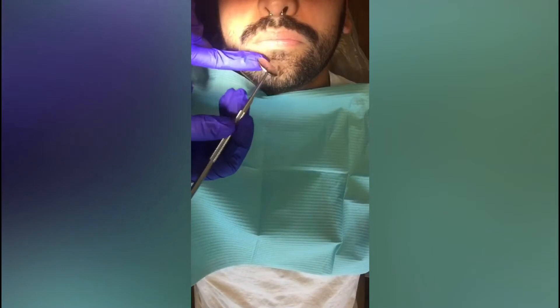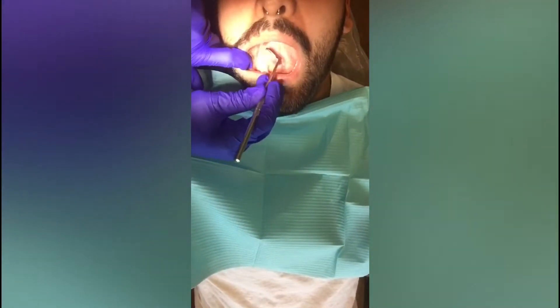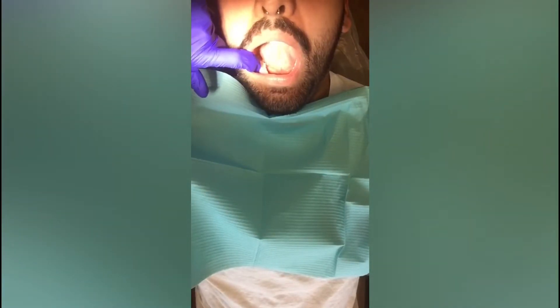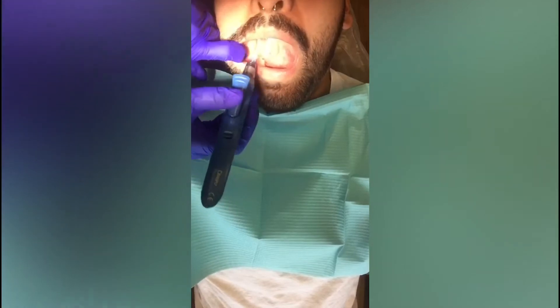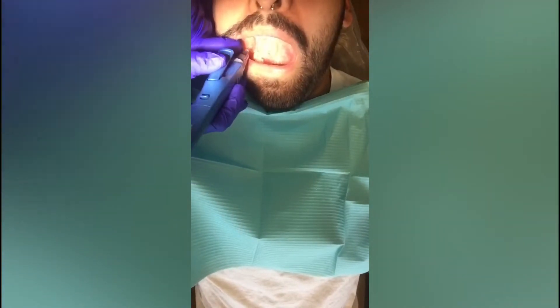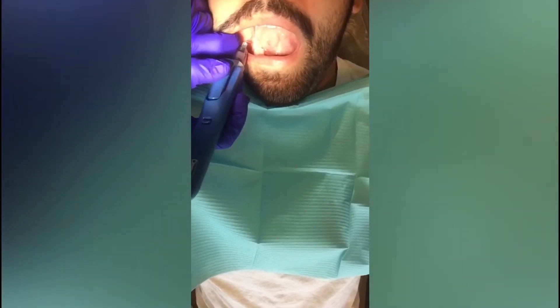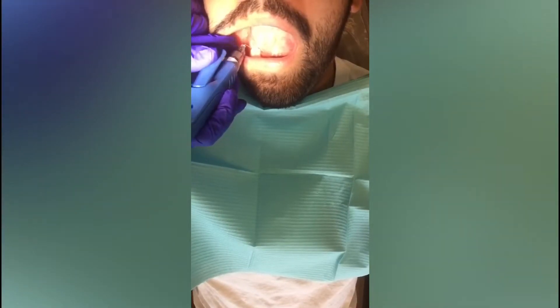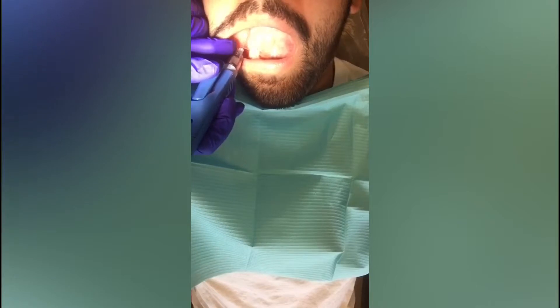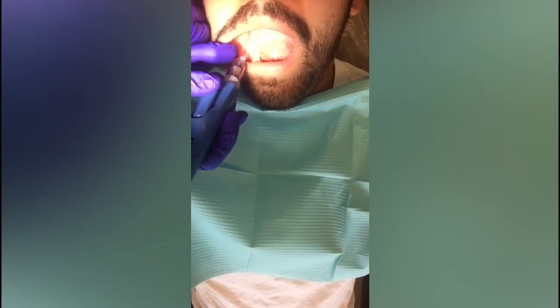We're going to be cleaning the lower right side today. I'm going to take this dispenser and start proximal here, just press down and administer a little bit of the gel. It's going to work its way around until I get back at proximal, and then we're going to administer some more and just keep moving around. Obviously you want to use suction because it tastes really, really bad.